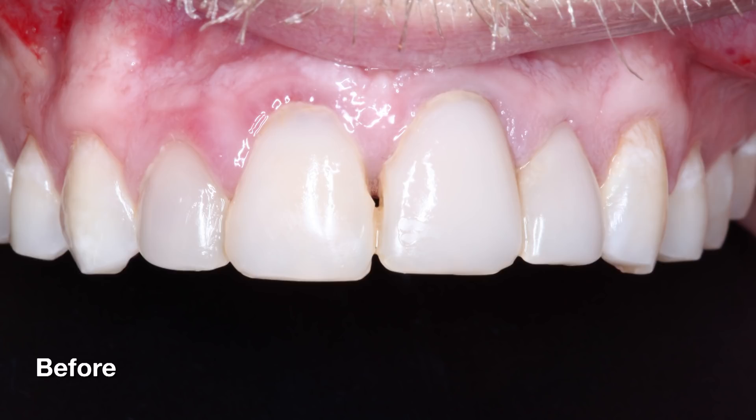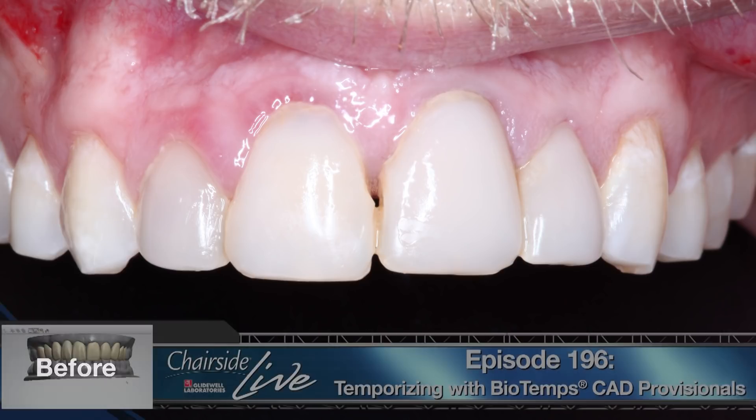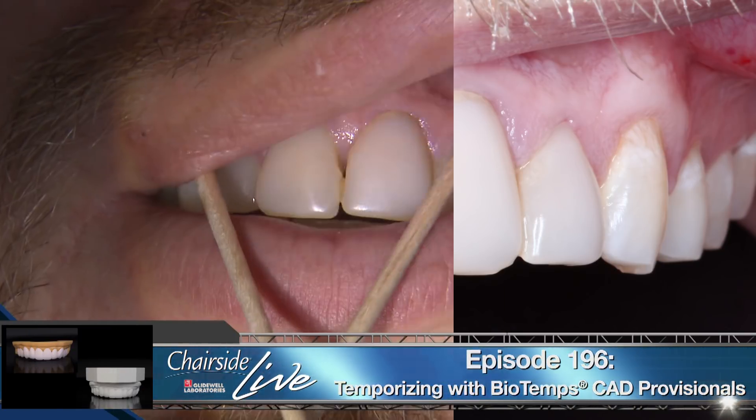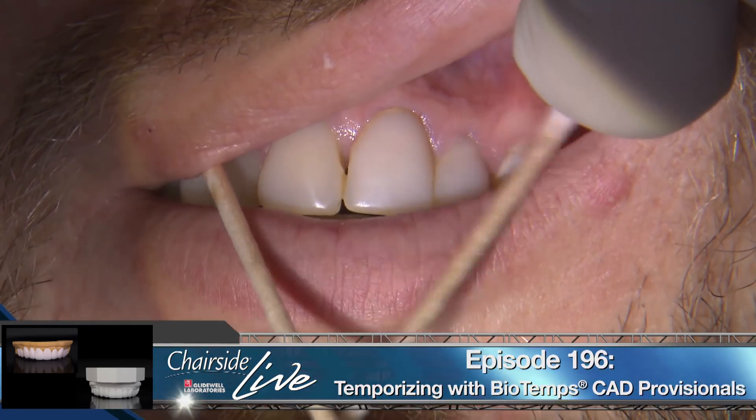The plan for the patient is to replace the old composites with Obsidian lithium silicate veneers. Before the prep appointment, I sent impressions to our fixed department where they designed a digital diagnostic wax-up to help us on the clinical side know if there are any possible limitations. Once the designs are approved, they send the digital designs to the bio-temps department to fabricate provisionals from those final designs. You can hear Dr. Murashan explain this process in more detail in episode 196.